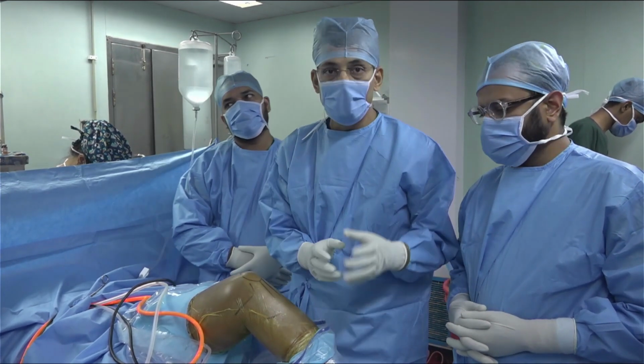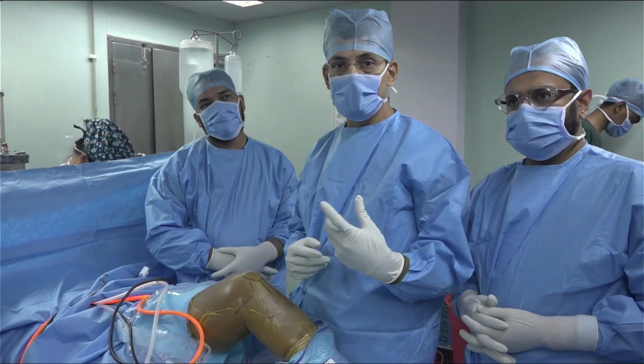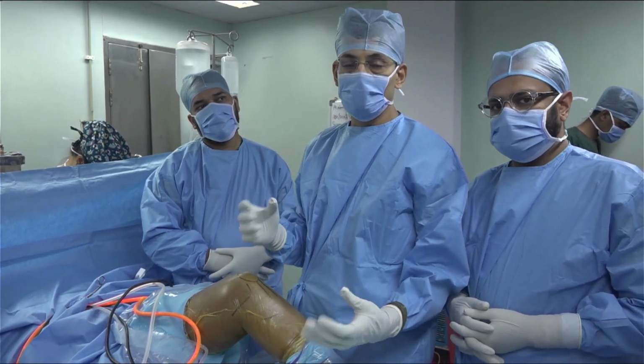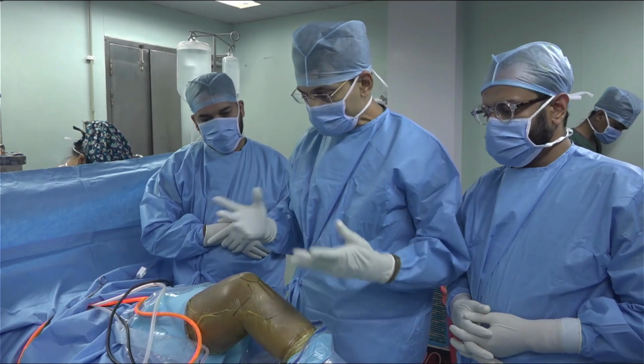And on the tibia, we will be using an adjustable button with a peak button. The peak button is a 17 mm button. It fits nicely, and it has the slots for the internal bracing as well. So you not only do an ACL, but you can augment or secure it with the use of an internal brace as well. So let's start the live surgery.